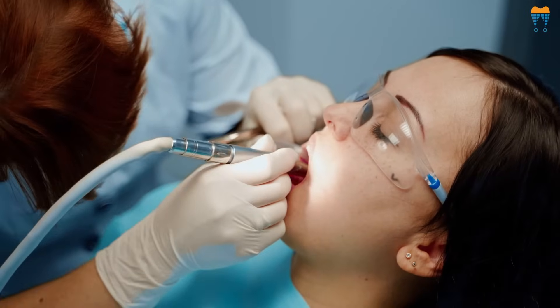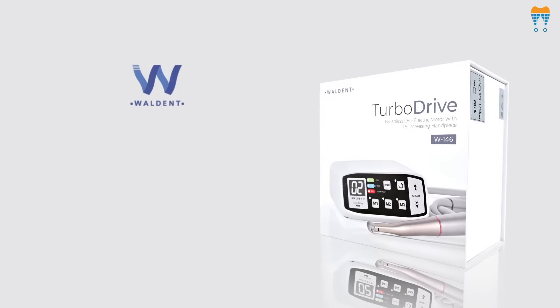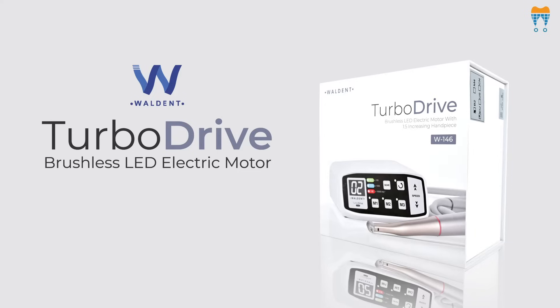In the world of dentistry, precision and efficiency are not just goals, they're necessities. Introducing the Walden TurboDrive Brushless LED Electric Motor with 1 Ratio 5 Increasing Handpiece.